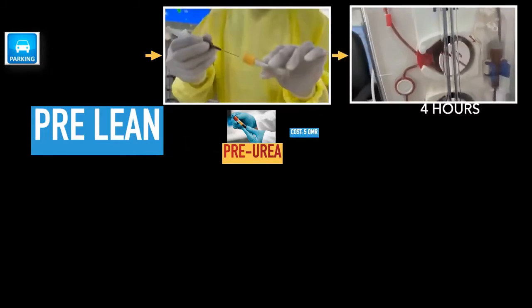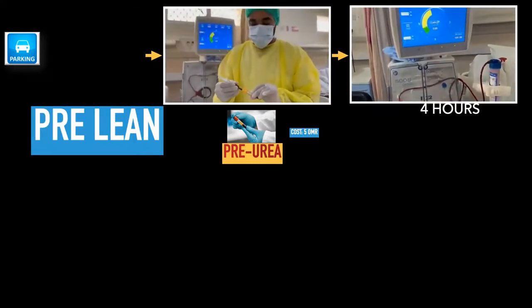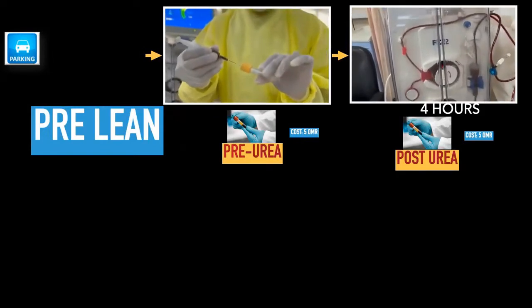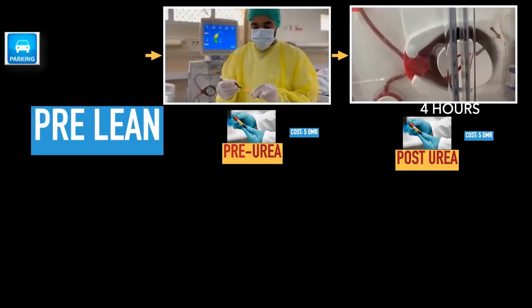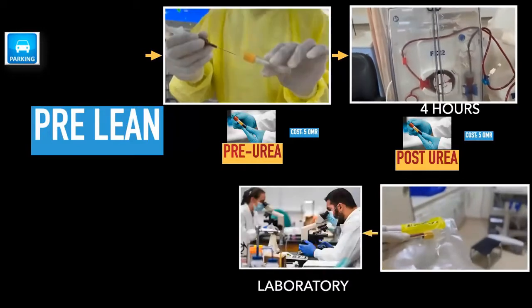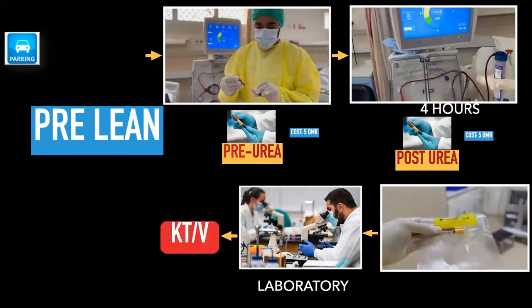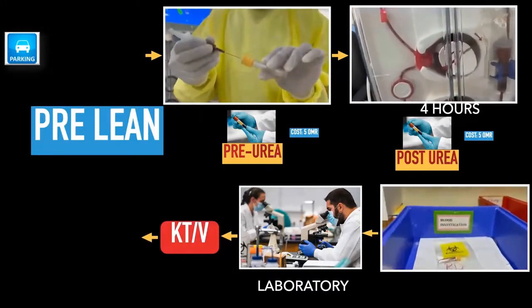Consequently, they undergo a 4-hour-long process of removal of toxins called hemodialysis. At the end of the session, another blood sample is collected. It is then called post-dialysis urea. Both samples cost around 10 riyals for each patient. Collected samples are then sent for laboratory processing. Once results are out, the nurse then calculates the Kt/V. Finally, results are then discussed with the physician.